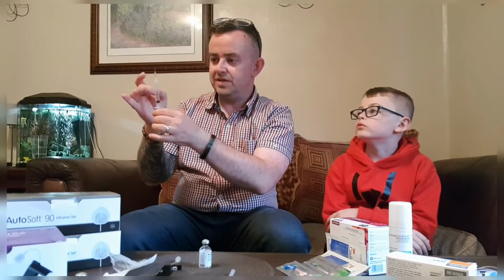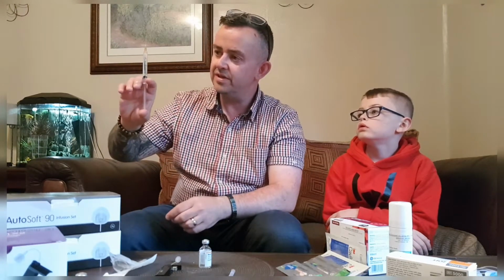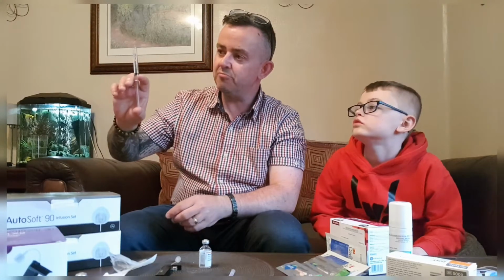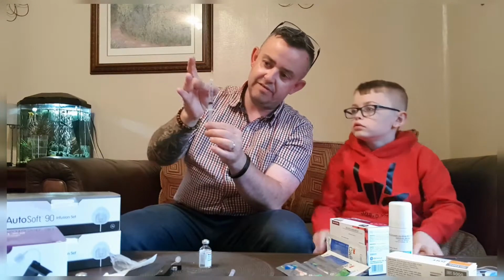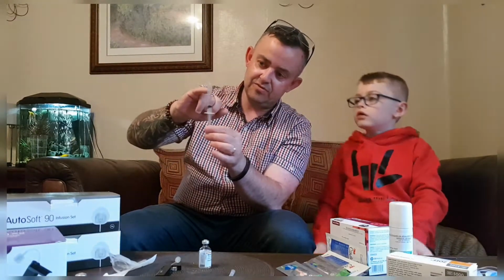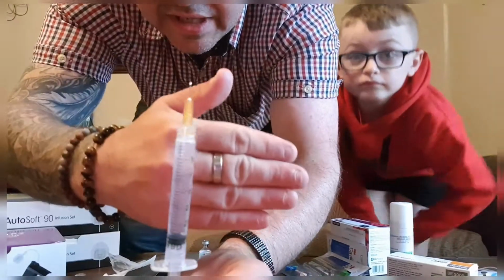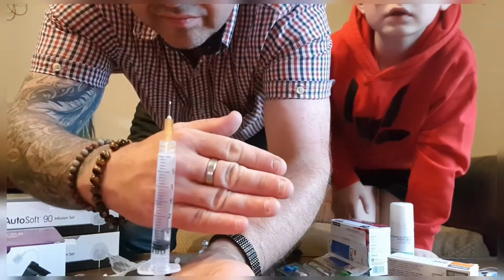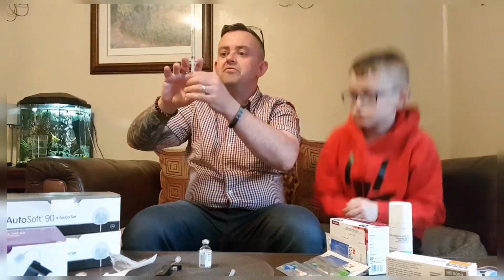That gets rid of any bubbles. There's quite a few in there. We're not bothered about champagne bubbles. Can you see when I flick it? You get all those champagne bubbles. We don't worry about those. We worry about the big ones.